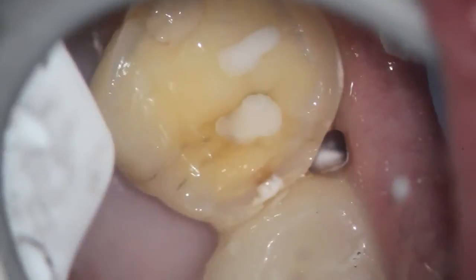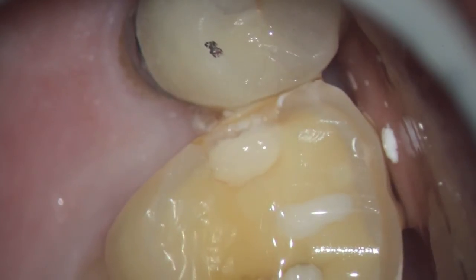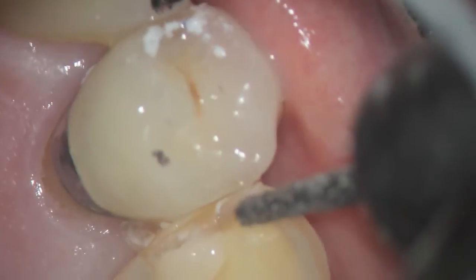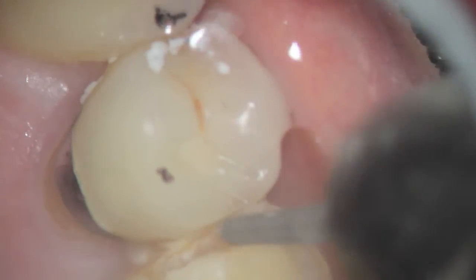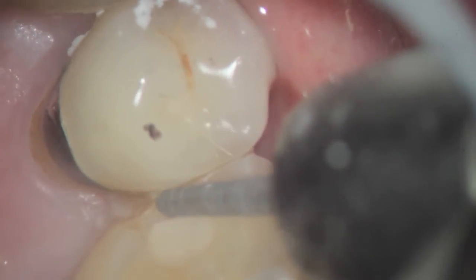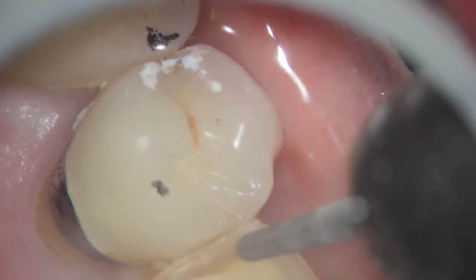You can see that there's some incipient decay that we're removing, and you can see the crack that was on the lingual that went all the way out to the buccal when that little filling was done. We're working now on the mesial aspect and removing the contact area so that the complete contact will be in the restoration — that will allow us to seat it very nicely.